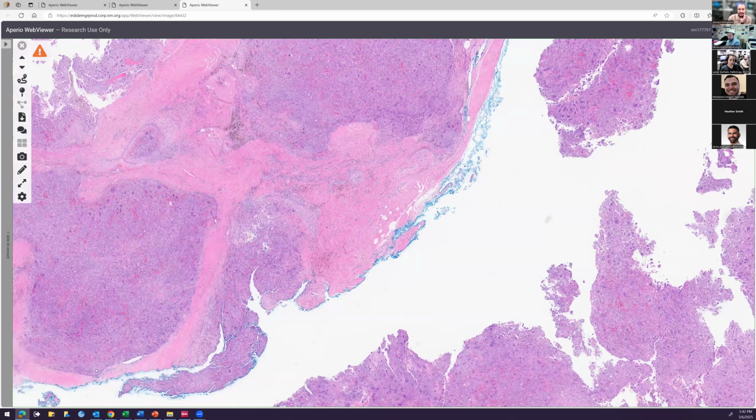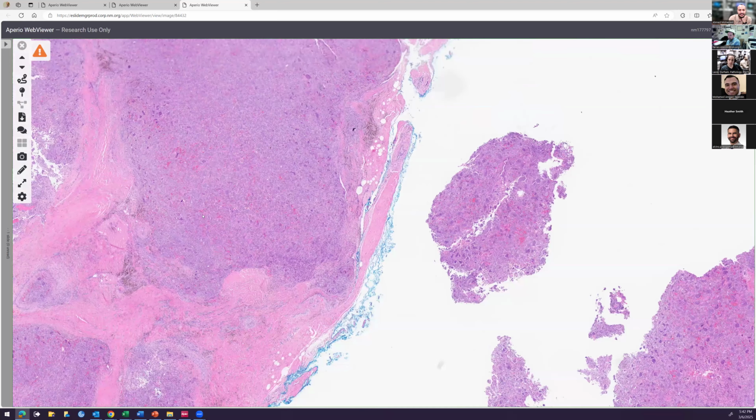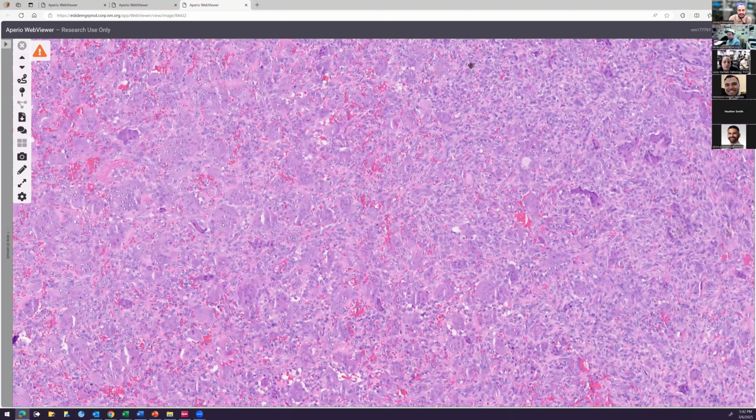But it's almost more like pseudocapsule. It's almost more like capsular tissue, weirdly enough. But when you go into the actual nodules, there's really very little fibrosis, right? So the lack of fibrosis throughout here, the heavy density of giant cells, and the more nuclei within the giant cells, making it look like giant cell tumor of bone, essentially helps that distinction between giant cell tumor of soft tissue and tenosynovial giant cell tumor.